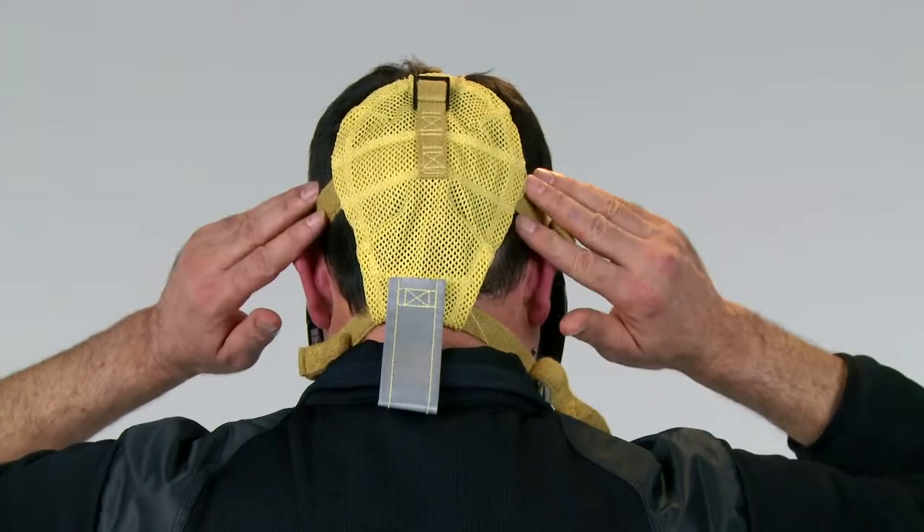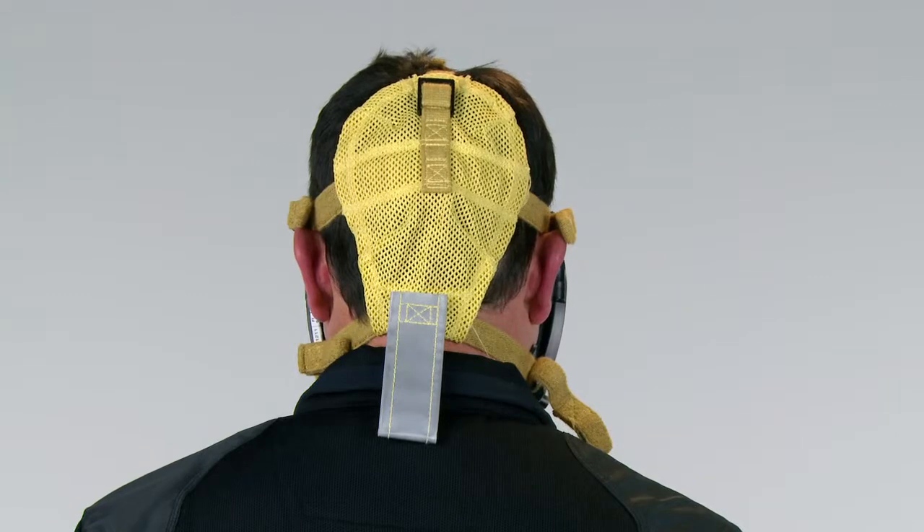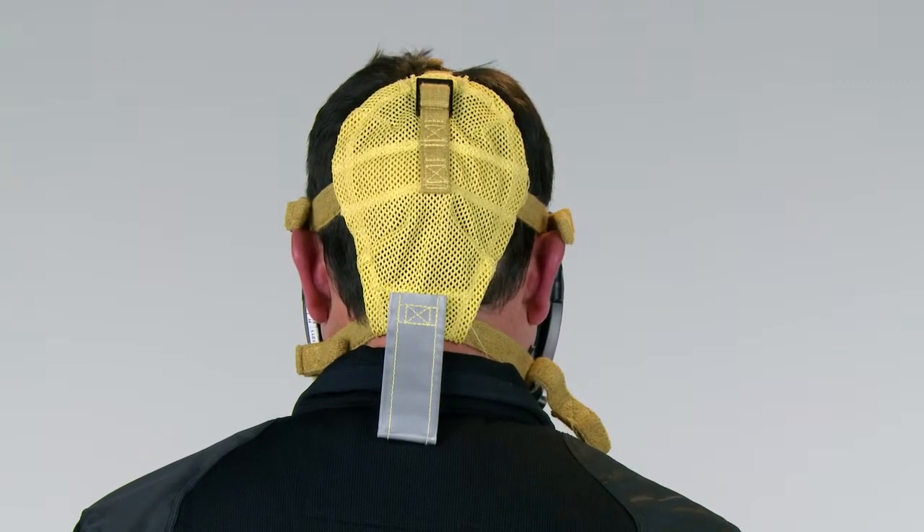Make sure that the straps are not twisted, the face seal is flat against the face, and there is no hair or clothing under the face seal.